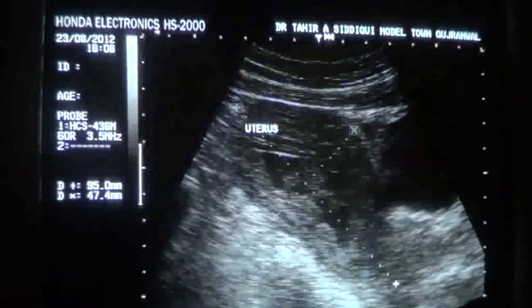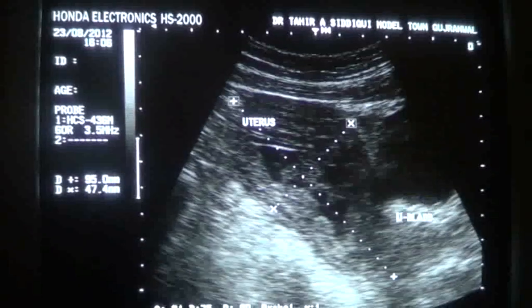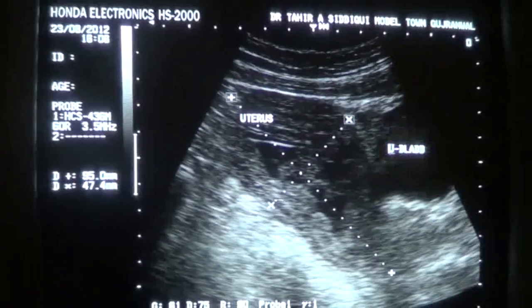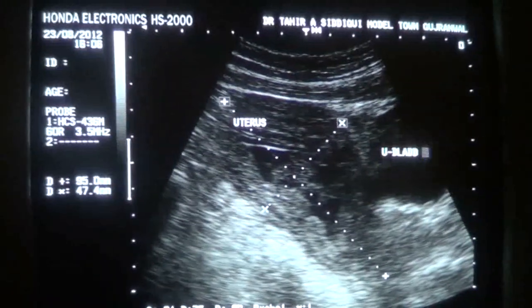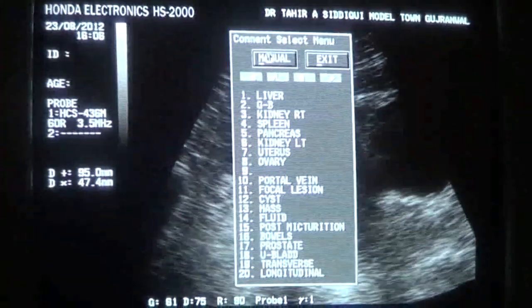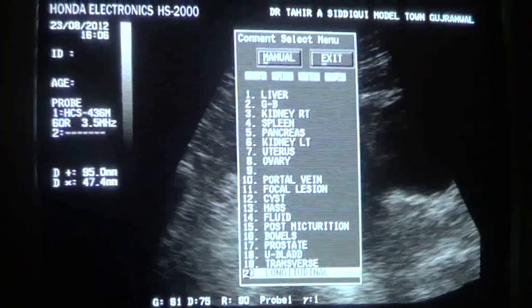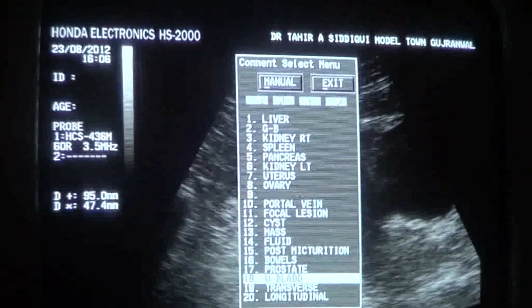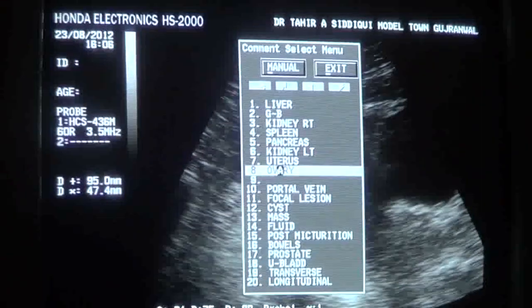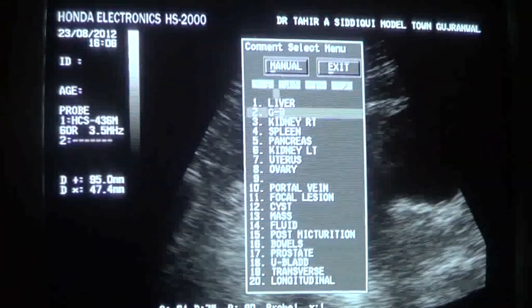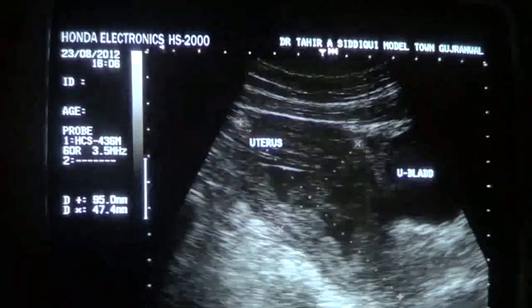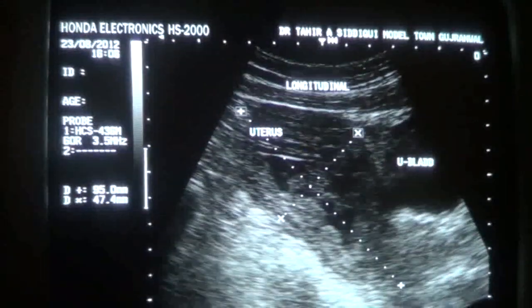This is the urinary bladder in this patient — a pregnant female. This is the longitudinal section.